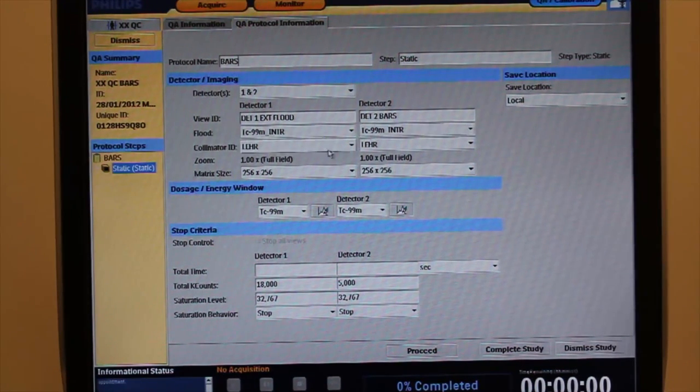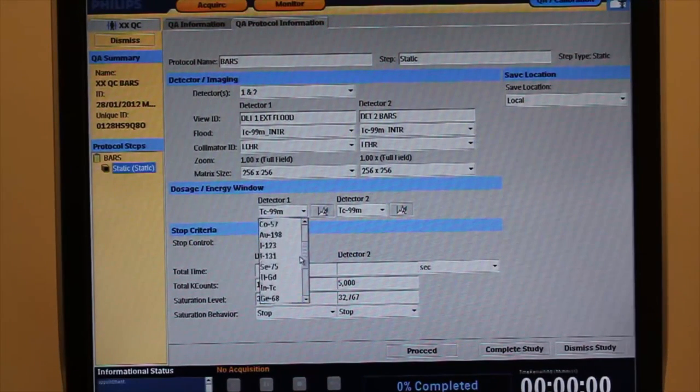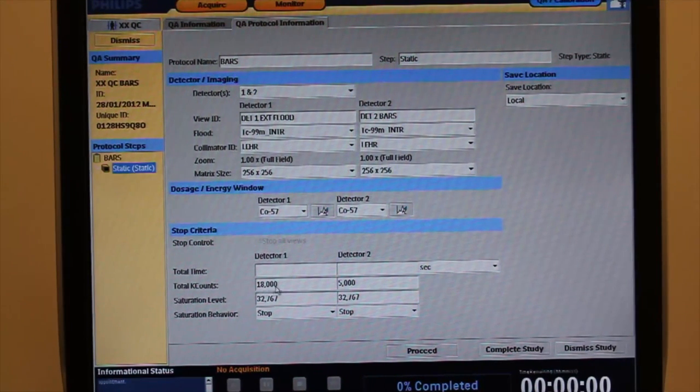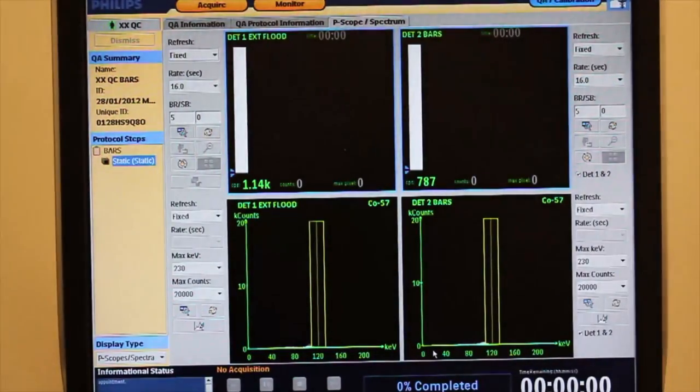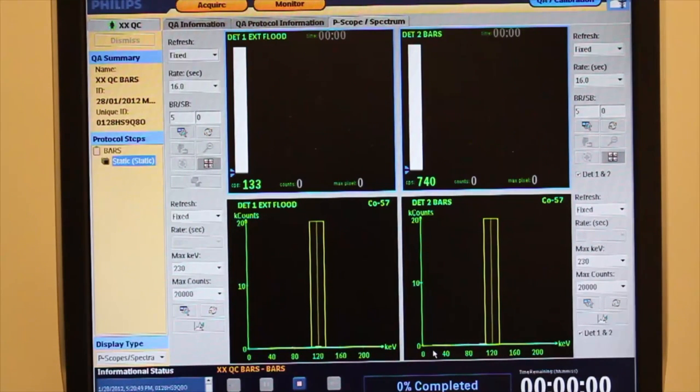Confirm the appropriate settings. Here we have detector one set up as an extrinsic flood since it does not have a bar phantom placed against it. Detector two is set up for the bars acquisition. We see a difference in counts: extrinsic flood is set up for 18 million and the bars acquisition is set up for 5 million counts. We selected Cobalt 57 as the isotope here since we are using the cobalt sheet source. Select technetium if you are using the fillable phantom sheet source.